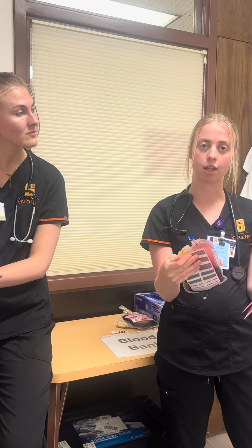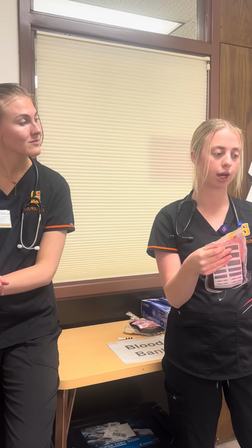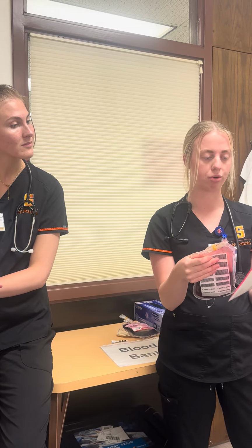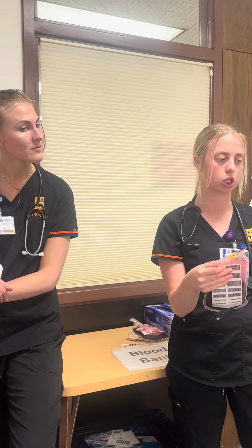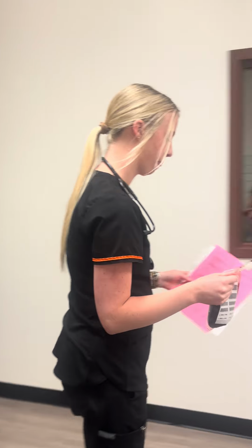If my nurse saw anything that was concerning, I would make sure that he or she could let me know and that we would check it. It says my patient's blood type's A positive, which I confirmed earlier with my patient, and O negative is compatible with all blood types, so I'm not concerned there. If you think everything looks good, we're gonna go administer to the patient.